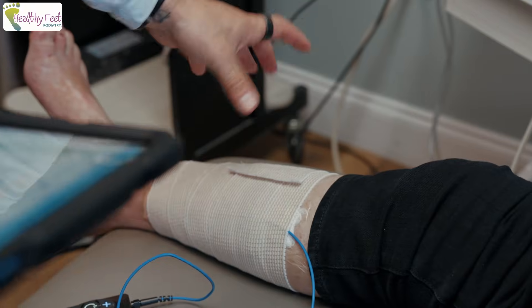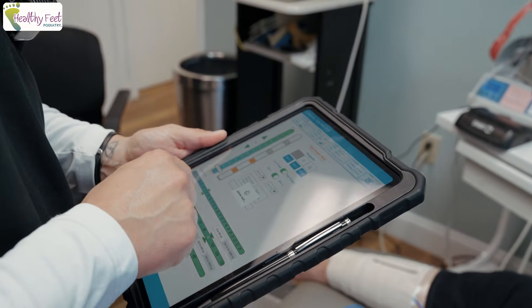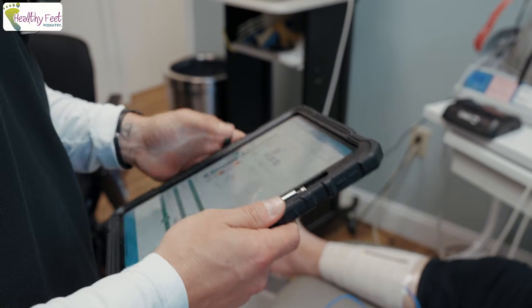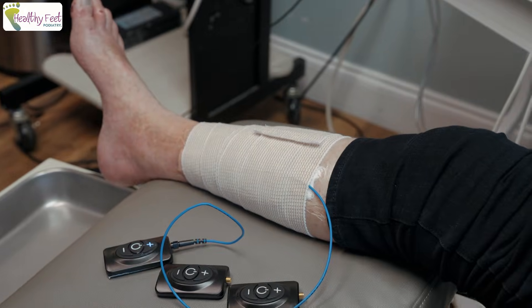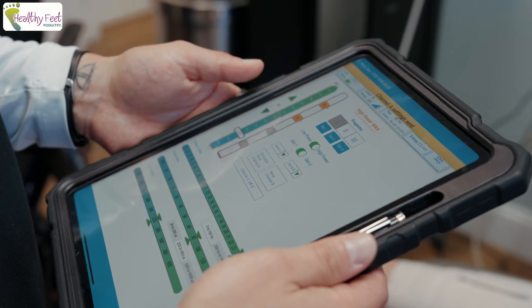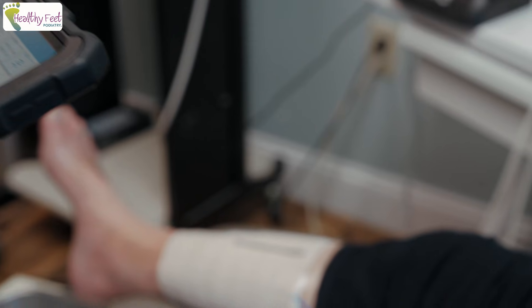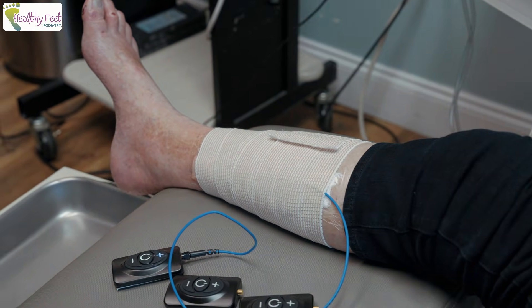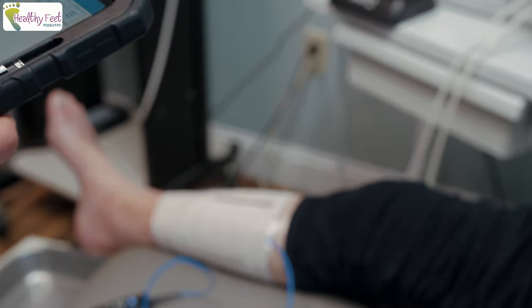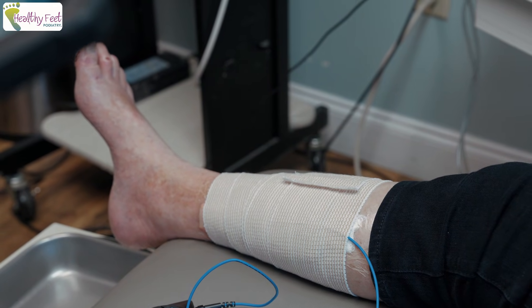Let me know if you feel any burning, tingling, any pressure or new sensation where you normally have pain. It's okay if you do not feel anything. I'm going to keep moving up the ladder — just let me know if you feel something. Patient reports: he's having sensations. It doesn't have to be painful — he feels a little ripple from his heel up to the bottom of his foot.